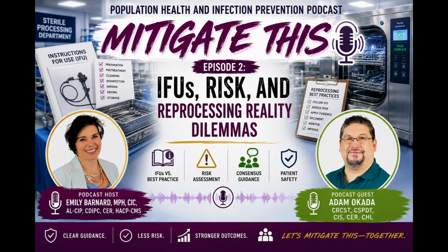Dealing with class 1 and 2 devices. Class 3, of course, is things like pacemakers, where the validation studies are a little more intense, and they have to prove that they were effective and that they work.